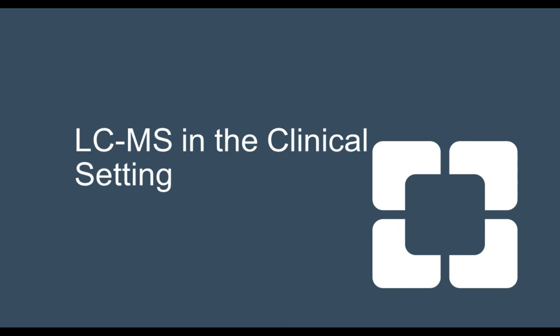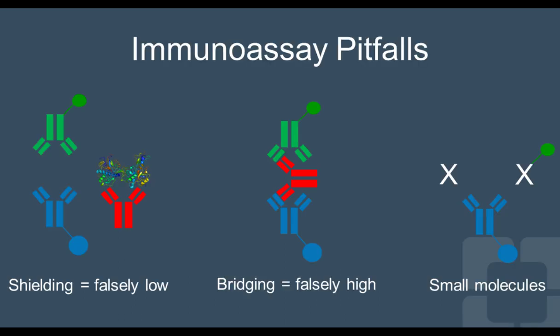Briefly, we'll talk about why LC mass spec, or this technique we briefly touched upon previously, is important to the clinical laboratory. Immunoassays are often utilized in the clinical laboratory, but they have several drawbacks.